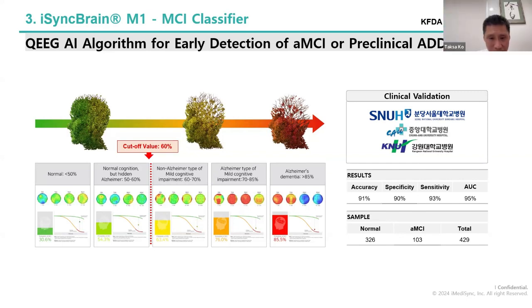But behind the summary report, there is a comprehensive report in the portal. Using that comprehensive report, once we understand it, we can give the explanation and also design the photobiomodulation intervention.